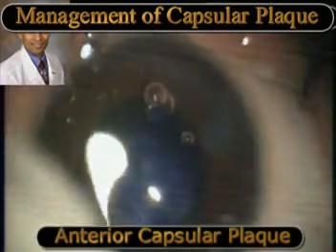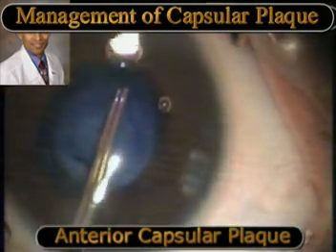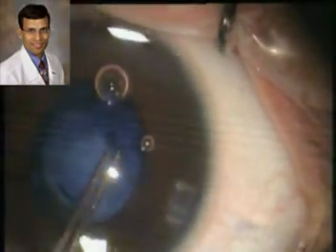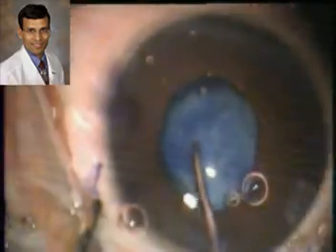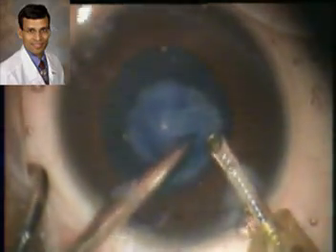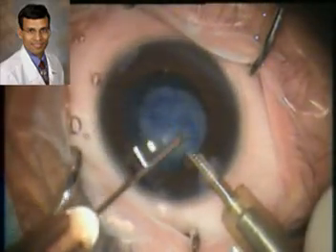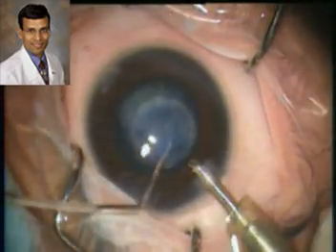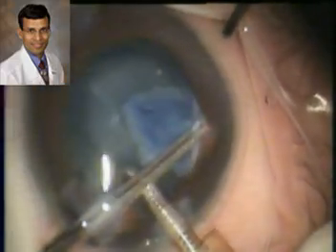Here we see an anterior capsular plaque, and it is dense and extremely adherent, and it is extremely difficult to remove it. We are attempting to remove it by performing a capsulorhexis. The anterior chamber maintainer helps in maintaining the anterior chamber during the procedure. As you can see, it is an extremely difficult and tenacious anterior capsular plaque which is removed with a lot of difficulty. And here we have the anterior capsular plaque that has been removed using a capsulorhexis forceps.